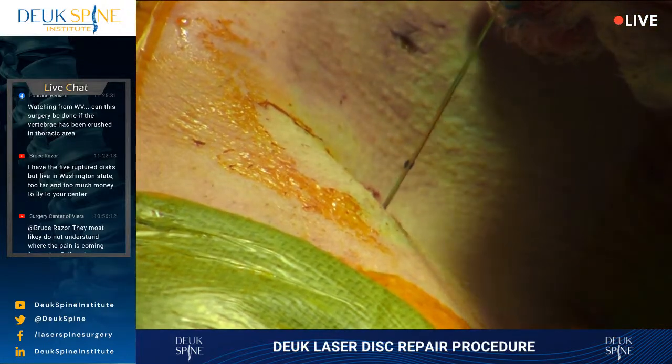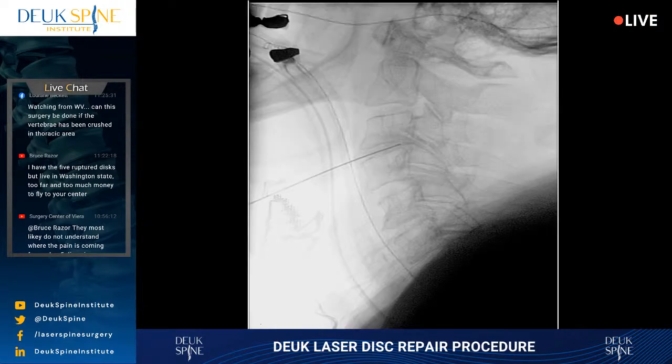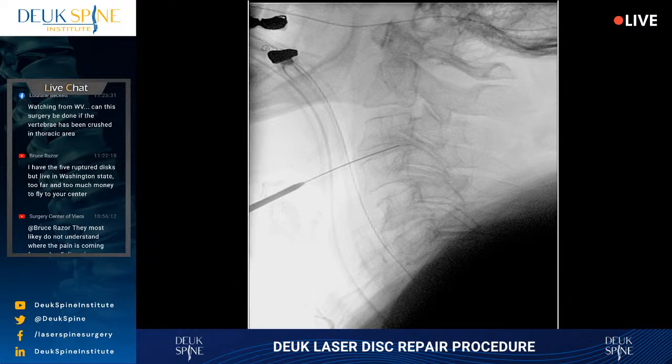Shot. Looking good. So we're coming down the guide wire with the dilator, and I'm going to dilate down. Shot. I want to keep checking my guide wire to make sure it doesn't go in any further into the spinal cord or come out into the neck. Shot. I want to keep a close eye on it as I gently and carefully advance the dilator down the guide wire to the front of the disc.